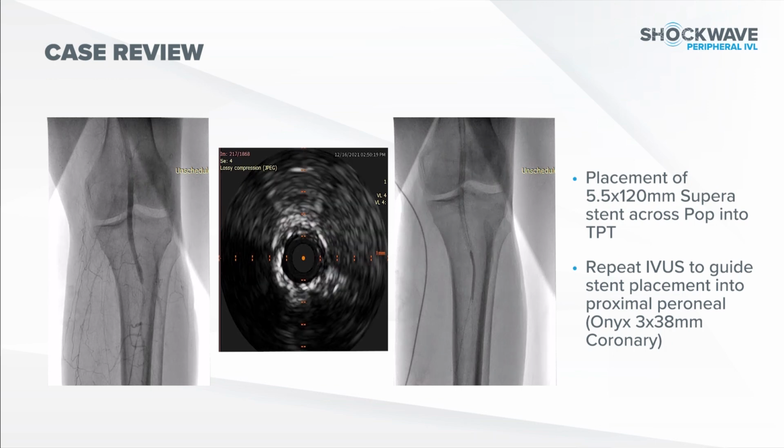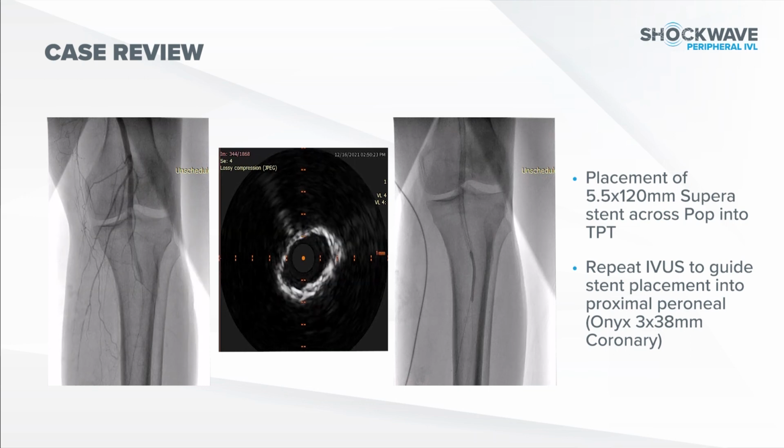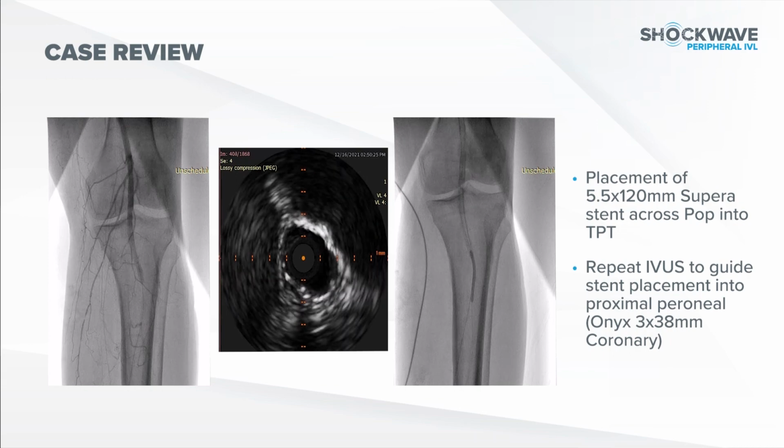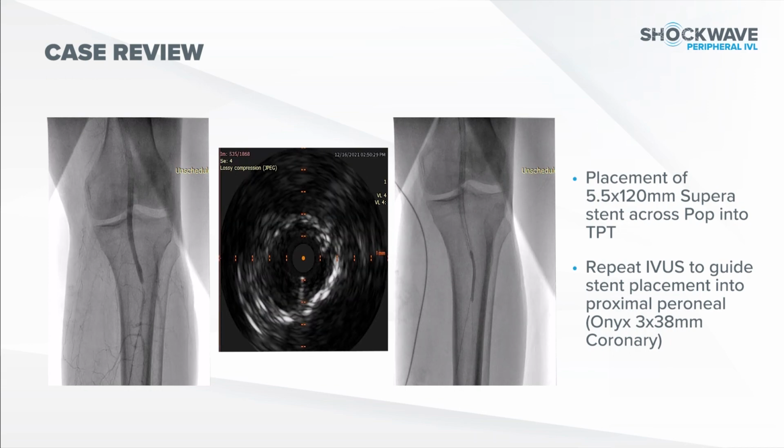And I was like, oh, let's understand this before we overreact. So we went in with IVUS, and we pull back again, and we see that we really just had a geographic miss distally, and we had a lesion there still at the outflow of the stent that was limiting the rest of this. There wasn't much dissection.